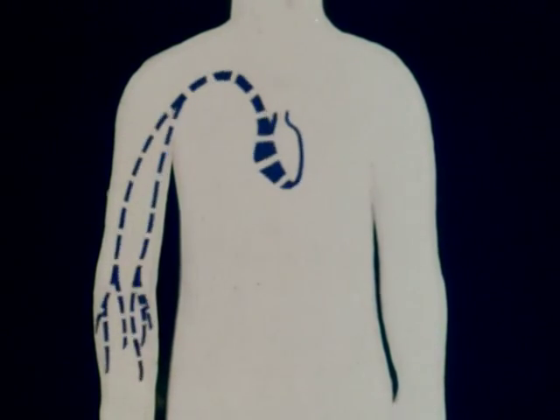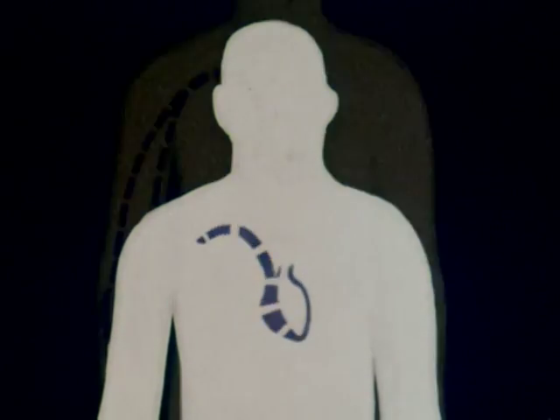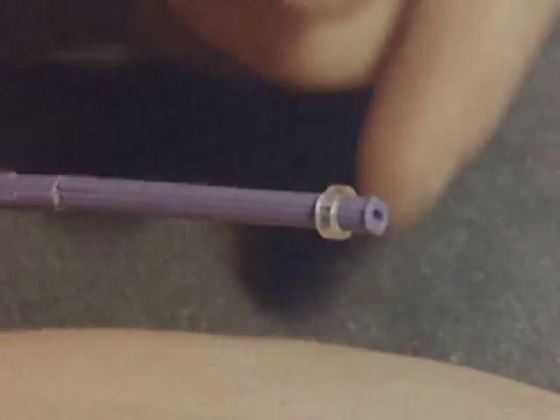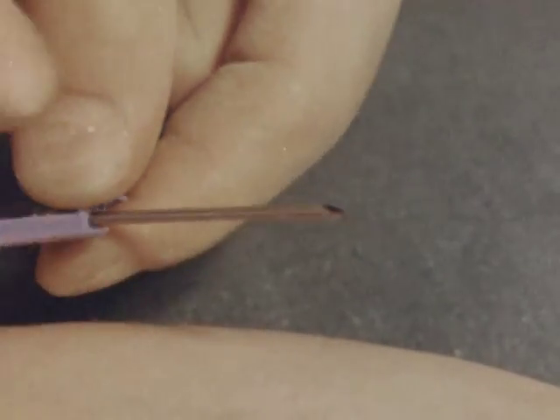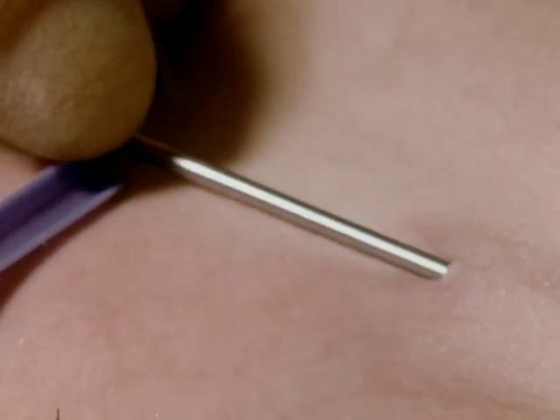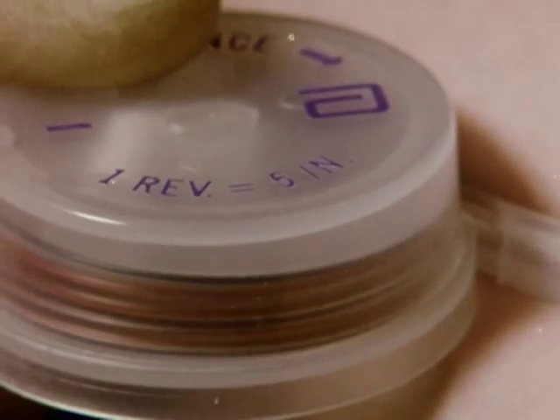The conventional routes for venipuncture are the arm, the internal and external jugular, and the subclavian vein. In this case, the arm route has been selected. To insert the catheter, the needle guard is opened and venipuncture is carried out. This X-ray film shows the movement of the catheter along the vein. The thicker line is a metal stilet, which provides the necessary rigidity for placement.